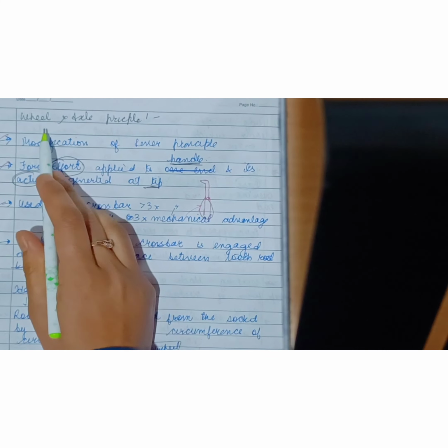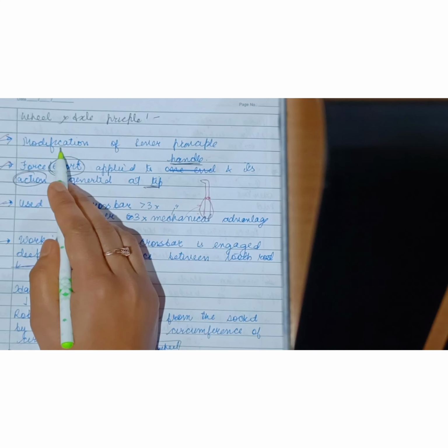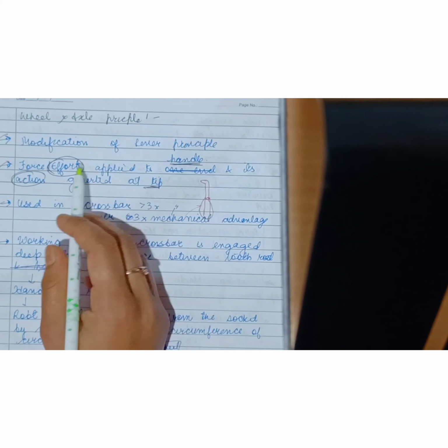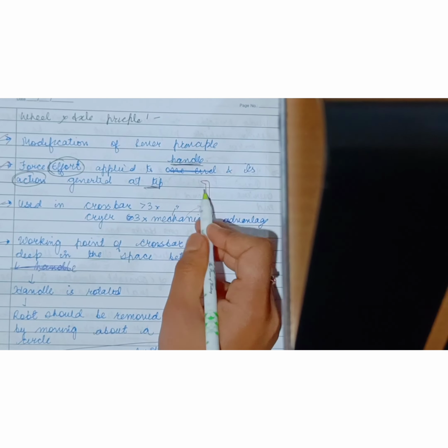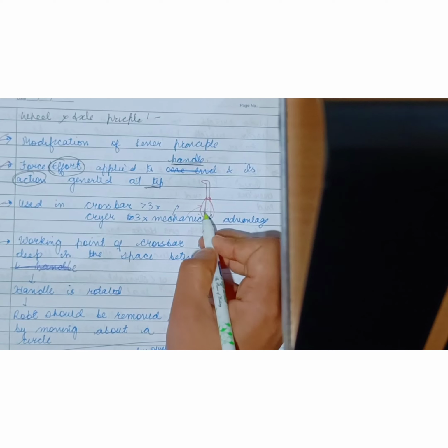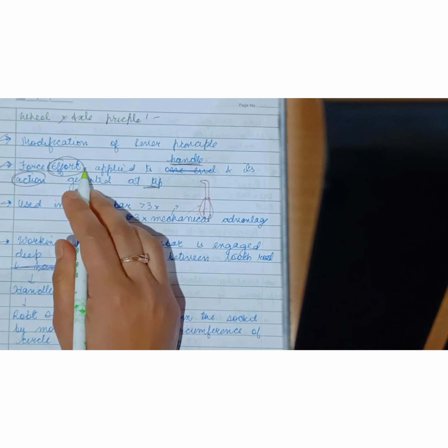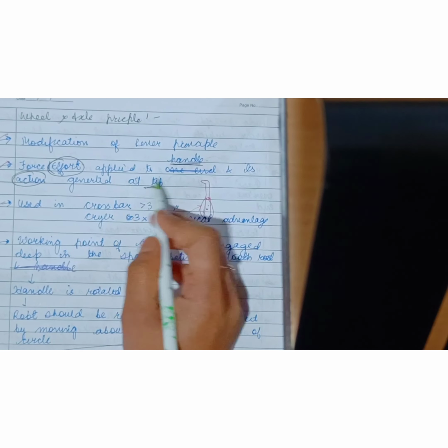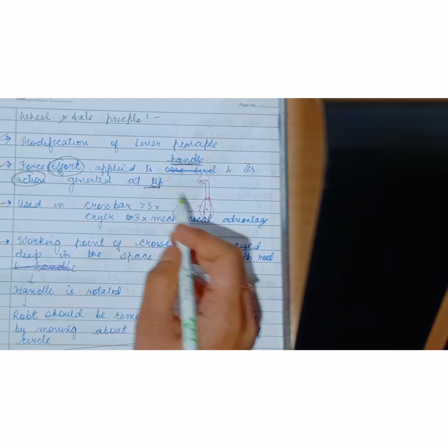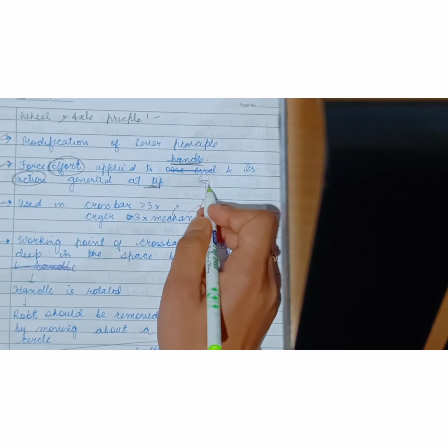The next principle is the wheel and axle principle. It is a modification of the lever principle. In this, the force or effort is applied to the handle. If this is an elevator, this is the handle, this is the blade. So the force is applied to the handle. We apply force here, and its action is generated at the tip. Okay, the force is applied to the handle, and action is generated at the tip.